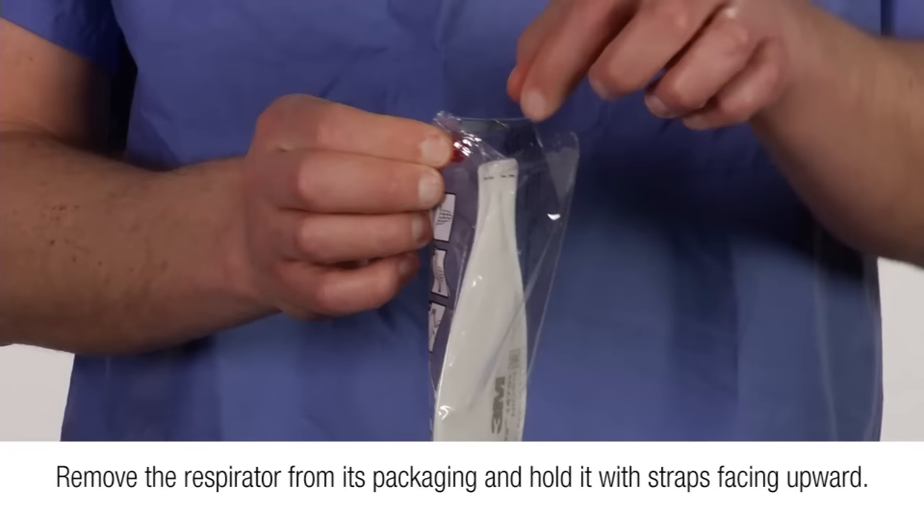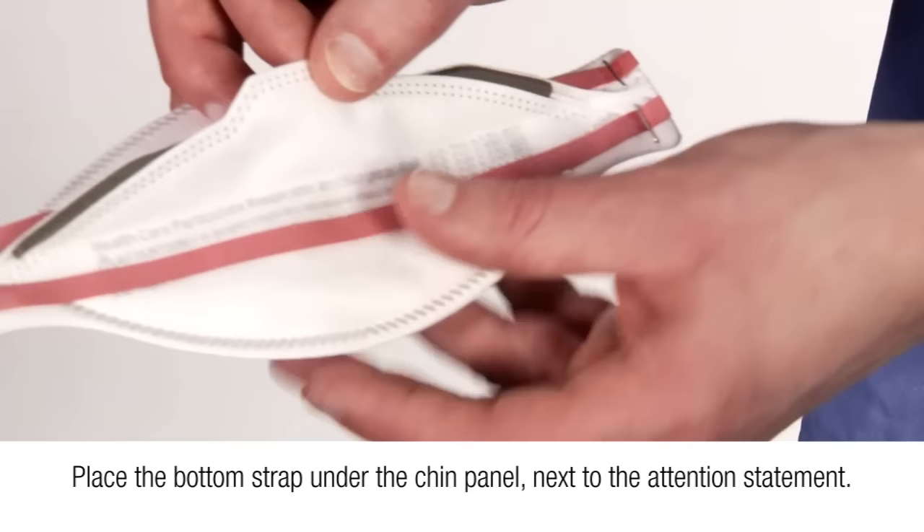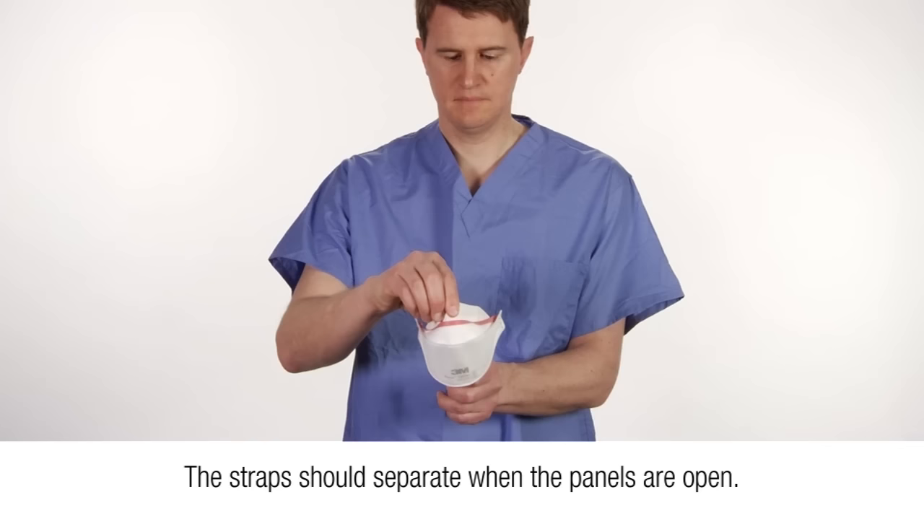Place the bottom strap under the chin panel next to the attention statement. Fully open the top and bottom panels, bending the nose piece around your thumb at the center of the foam. The straps should separate when the panels are opened. Make certain the bottom panel is unfolded and completely open.